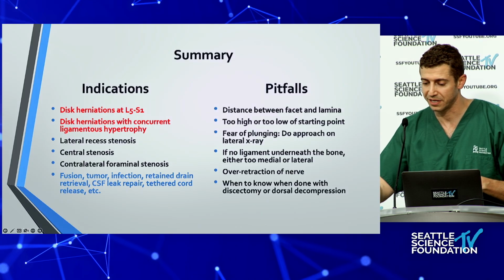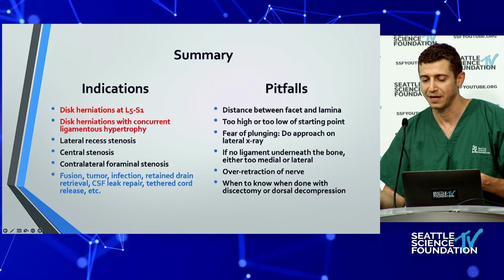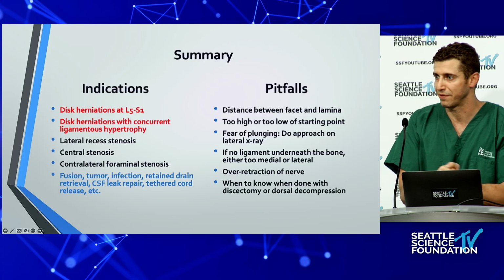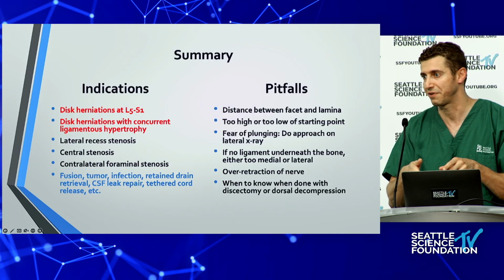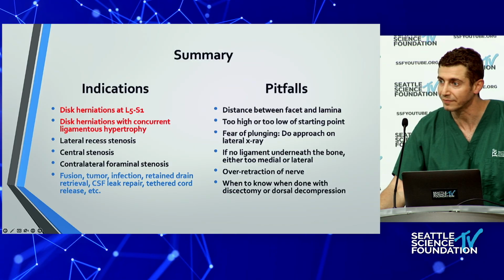And then like you said, in terms of the interlaminar approach, it's much easier for a surgeon because it's our usual anatomy. The hard part about it, I think, is the degrees of freedom of the scope. Transforaminal is the opposite. The anatomy is super hard, but once you're in the foramen, you're constrained. So it feels like you're not as tired at the end of the case.